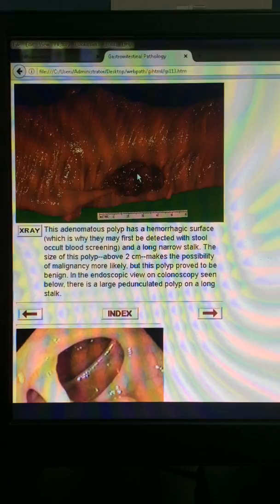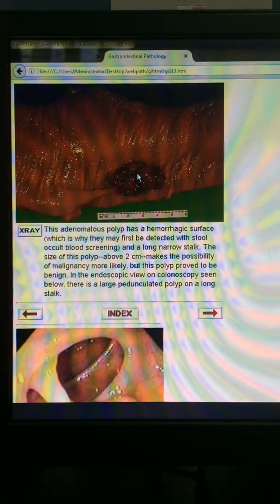The adenomatous polyps are classified according to the histological appearance into three types: tubular adenoma, villous adenoma, and tubulovillous adenoma. The tubular adenoma is formed of tubules or elongated tubular-like structures lined by the neoplastic adenomatous epithelium. The villous adenoma is formed of villiform-like appearance, and the tubulovillous adenoma is a mixture of the two components in the same polyp.